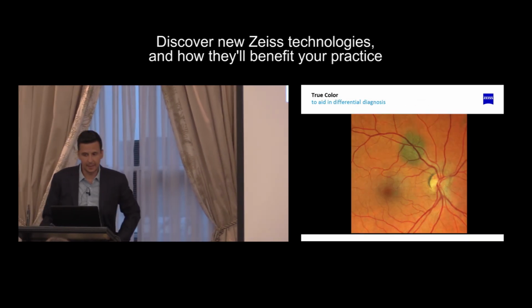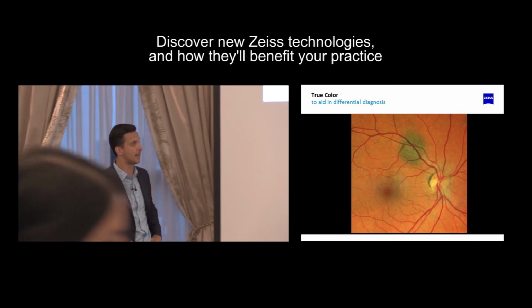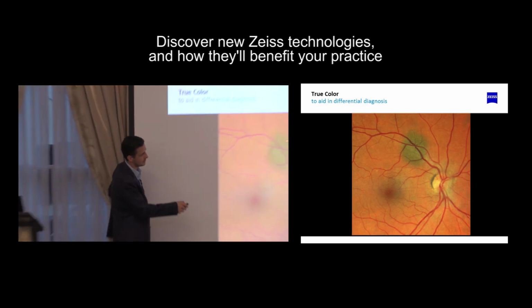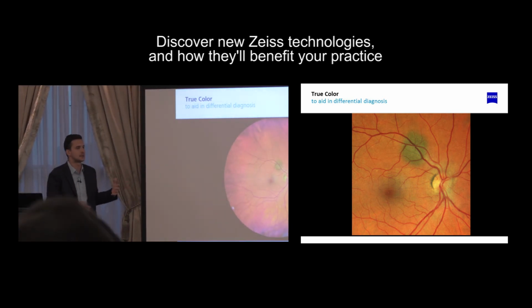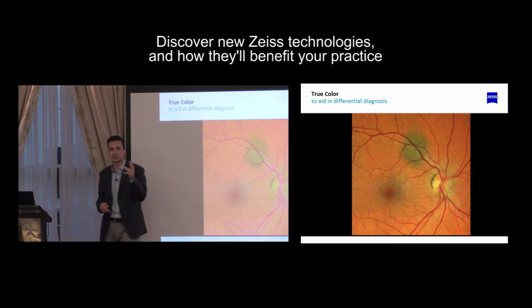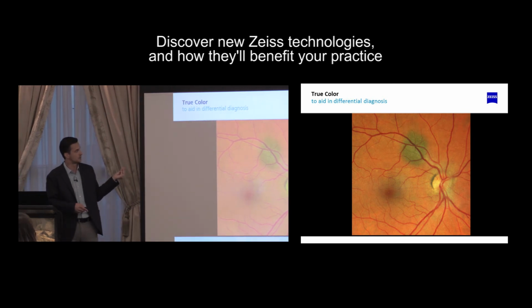So true color, and the reason I bring this image up is, again, back to just looking at it at scale. You can see how big that one is, and I could have got much larger. But what I'll point out to you here are these fine little drusen deposits, just in a differential. So we're looking at this, well, what is it, right? You're going to throw up different filters potentially on this. But in particular, when you've got it at scale and you've got no distortion, you actually see what's happening in the anatomy in this particular set of images.